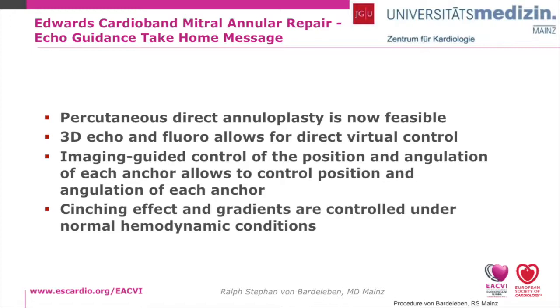As we know, the time is short, we can just take one question from the audience. One question is asking, is there a risk of dislocation of the clip or embolization? If so, what is the treatment? And the other one is, what are the potential peri-procedural complications of TOE? We have one or two minutes for the answer. Okay, I'll keep it short.